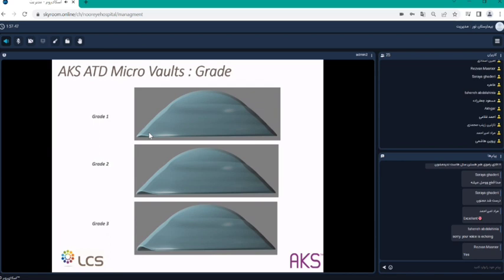So in some cases, like a quite advanced stage pterygium. But to be honest, we use most of the time only the grade 1 or grade 2. This is most of the time sufficient to have a good fitting.